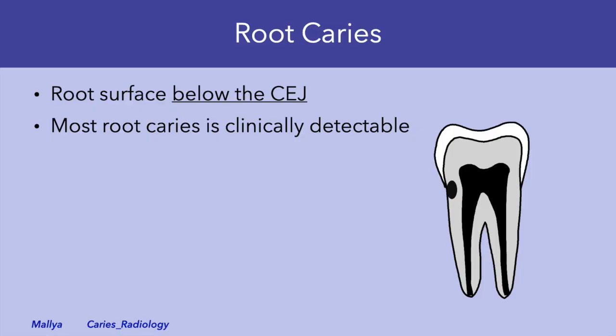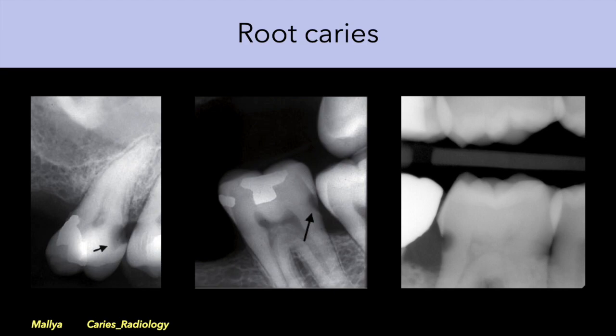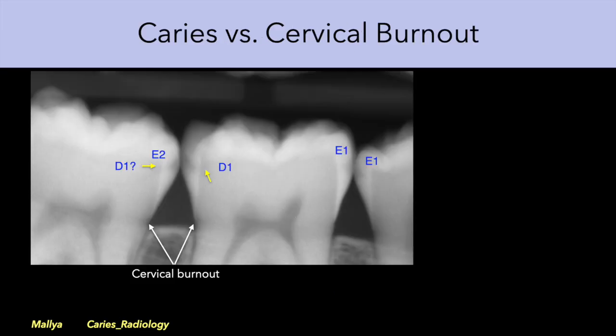Root caries occurs on the tooth surface below the CEJ. Most root caries are clinically detectable, so our diagnostic task when imaging root caries is not to detect the caries, but rather to determine the extent of the lesion and its proximity to the pulp. Note that the origin of the radiolucency appears to be at or below the CEJ, although the radiolucency extends into the coronal dentin. When assessing for root caries, remember to distinguish between root caries and cervical burnout — unlike root caries, cervical burnout is more diffuse and does not have a distinct outline.